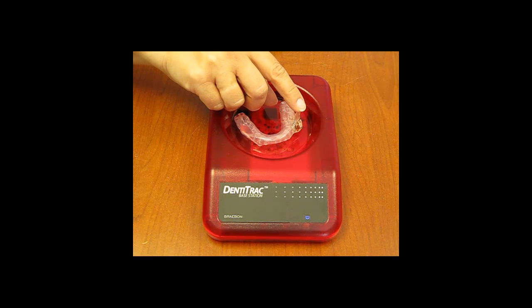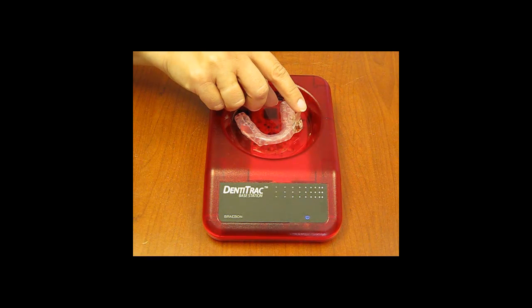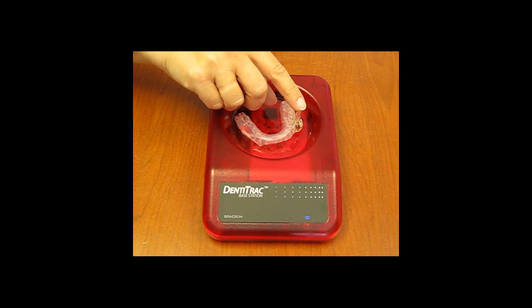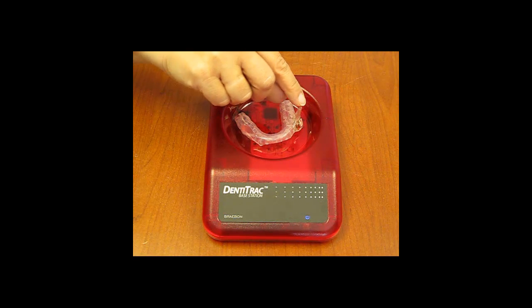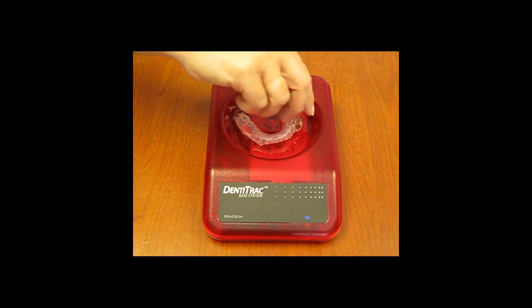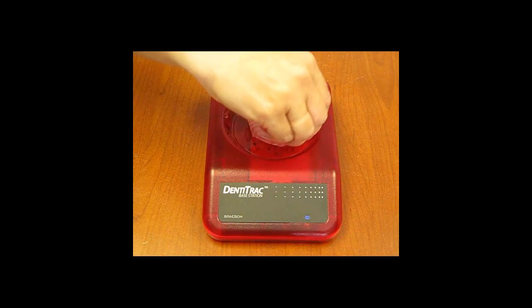Place your oral appliance into the base station with the dentitrack facing the center of the base station, positioned at either 3 o'clock or 9 o'clock.